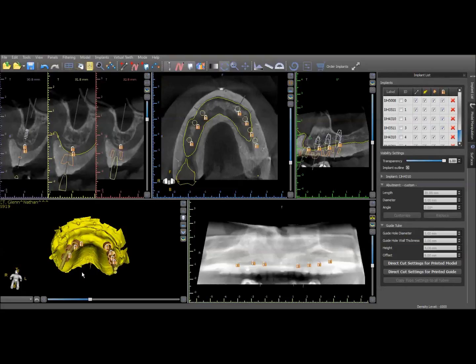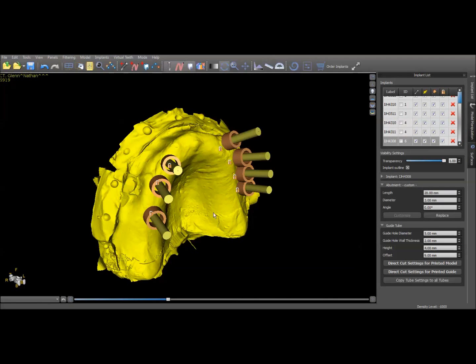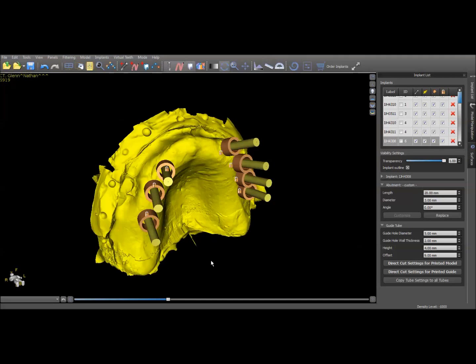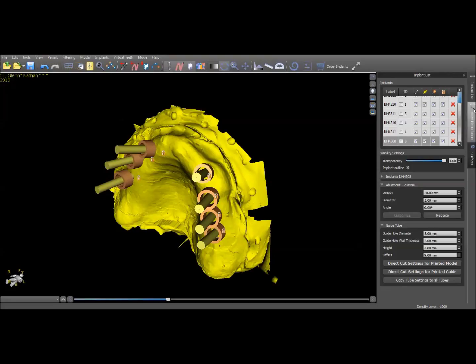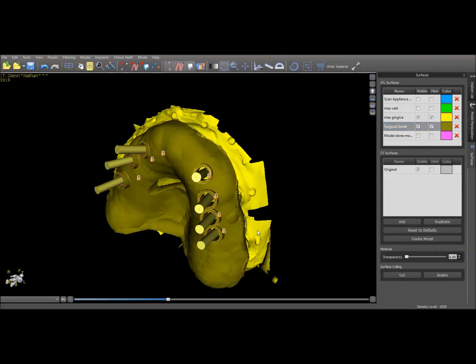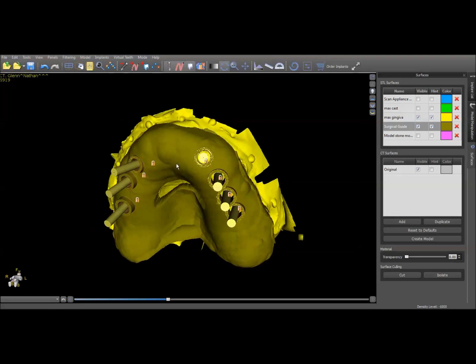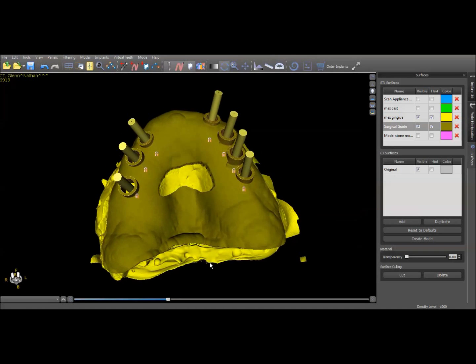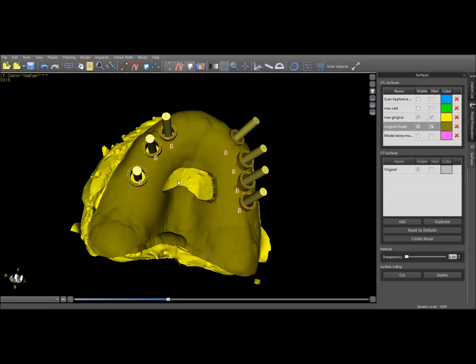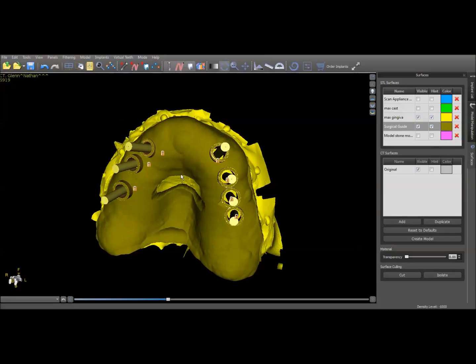At this point it becomes very easy to create the guide — we already know where our implants are going to be emerging from. You would go about designing your guide in the typical way: plot your points around the periphery, define where you want the extent of your guide to go, and then allow the software to process it. What you end up with is a guide like this — you create little windows so you can see that it's fully seated, and you want it to extend up into the vestibule. This should be very nice easy surgery because we know it's going to exactly fit against the tissue surface.